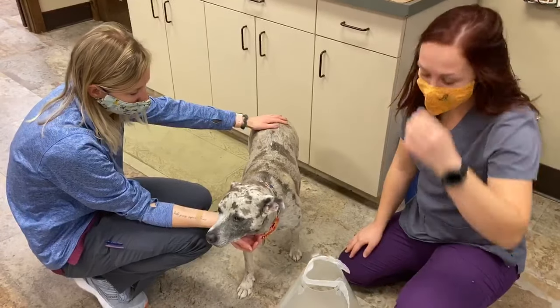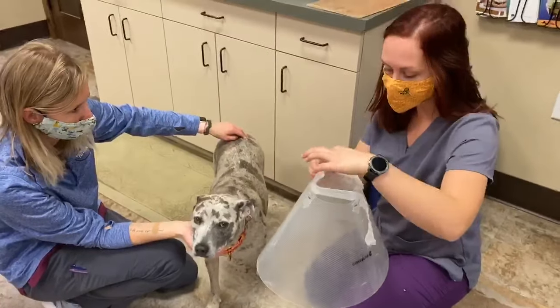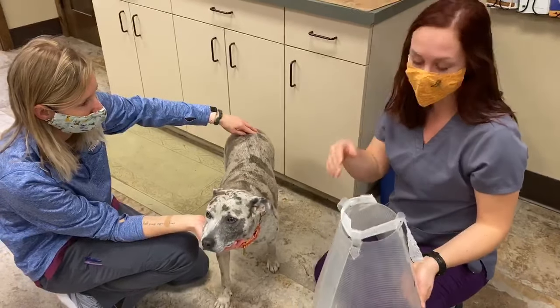Today we're demoing how to put an e-collar on a dog. A basic e-collar is going to be plastic and has these little loops. You can either use gauze through the loops or you can put their collar through the loops. Today we're just going to use gauze for an example.